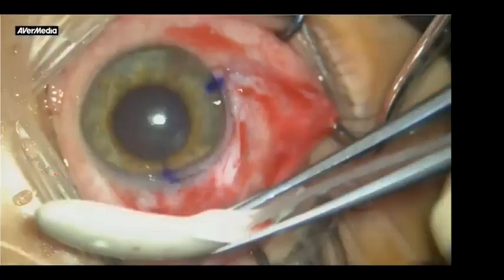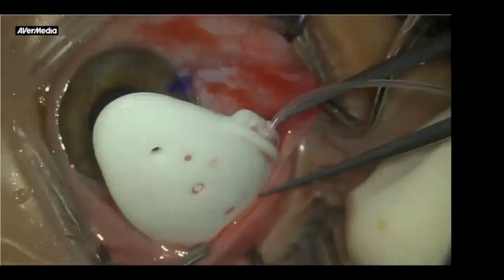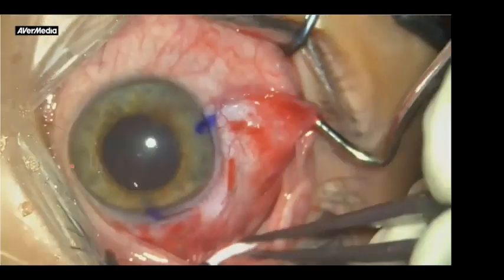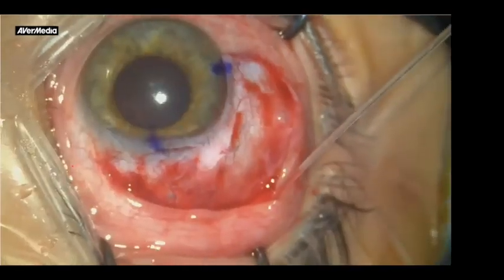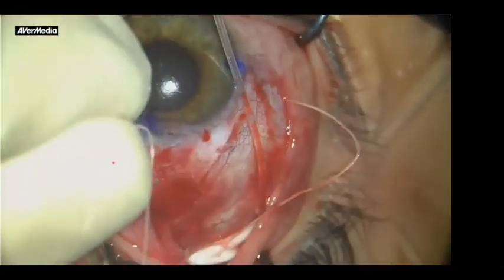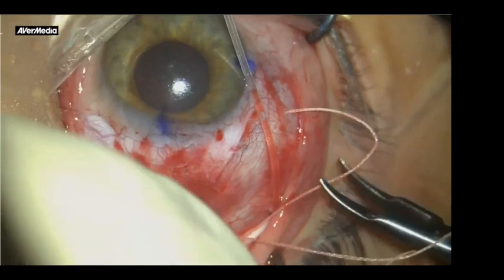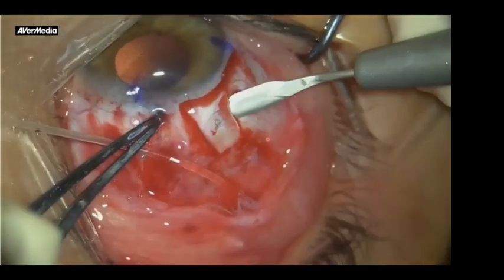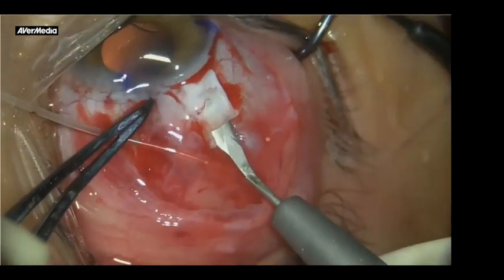And then this is Baerveldt or Aurolab. I'm not using it actually because it's very bulky. It needs a lot of work, and the wings will go underneath the muscle. And this is one of the non-valvular implants. That means after you fix the plate, you need to ligate the tube. You need to ligate with absorbable sutures. I put 2 absorbable sutures until the peri-plate capsule is formed, and then it will spontaneously work.